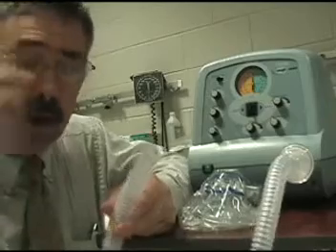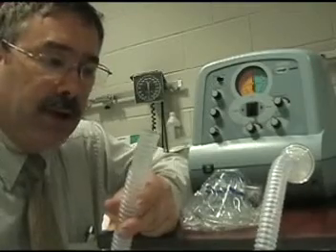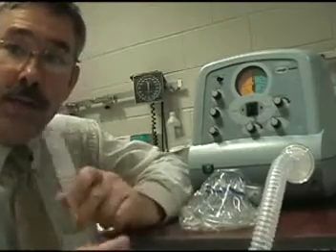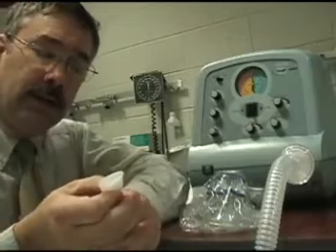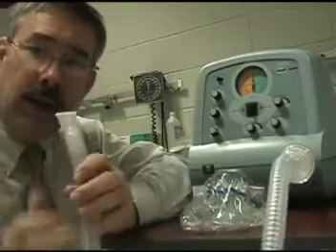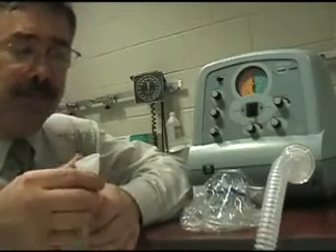Next, we want to adapt the end of the tubing so that our patient can take the therapy. Some patients can do this with a simple mouthpiece — they just need this little mouthpiece which fits right on to the end of the tube and they simply breathe in it. In some cases they may need to hold their nose or use a nose clip. That's only for patients that have been trained and find that this is something they can tolerate.